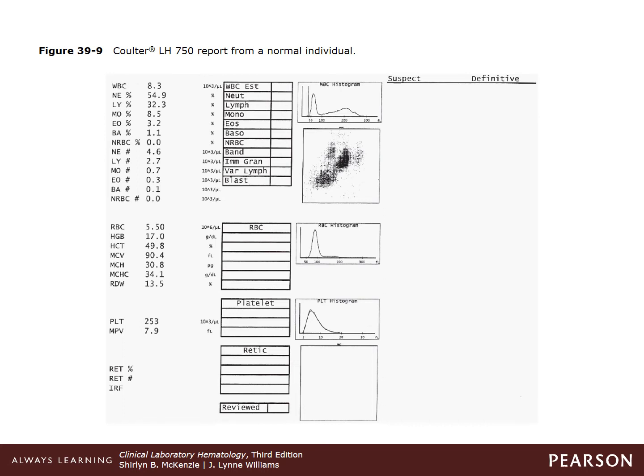The red cell histogram allows you to visually see the changes in size within the red blood cells. For example, if we have a normal size of cells and there's a shift to either the left or right, you can see within the histogram if there are any red cell disorders, if the cells are going to be smaller or if the cells are going to be larger. So it's like a double check. The instrument can directly measure the red blood cell count, the MCV, and the RDW. In the calculated counts based off of these, it will calculate the hematocrit and the MCH.